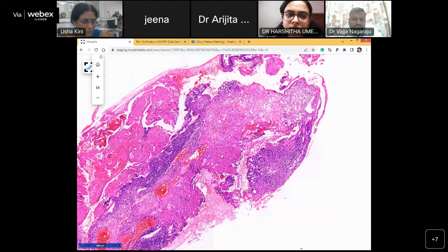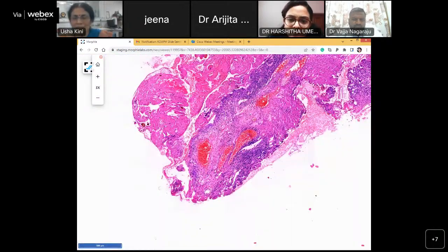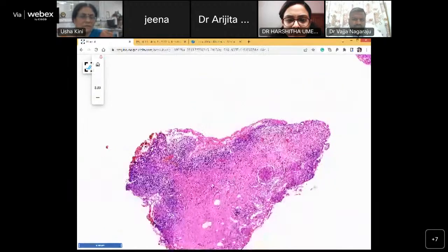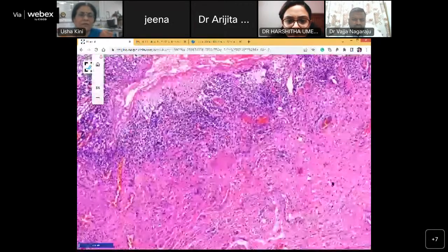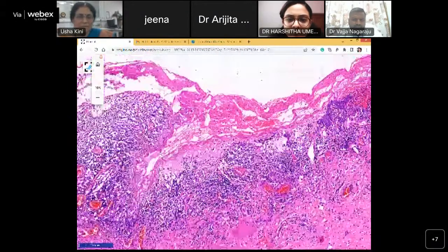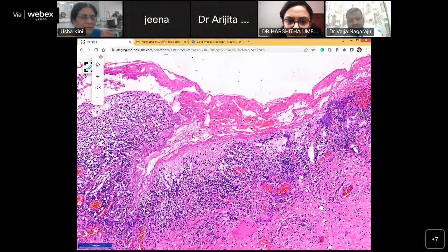She pointed out granulomata. Yes, there are multinucleate giant cells. Here there are some multinucleate giant cells right over there. This is ulcerated. It is covered by fibrinous exudate. So we do not know what epithelium was here. Probably anal or transitional mucosa. It is perianal abscess tissue that has been sent.